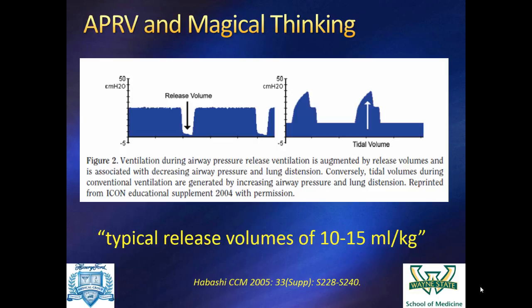So here we're going from one pressure to another, right? We're going from a pressure, let's say, of 10 to 30. Here, because we say we're going from a pressure of 30 to 0, somehow that's better than going from a pressure of 0 to 30, which is all we're doing. We're just doing it in the other direction. But somehow this is thought to be safe, and this is thought to be dangerous, and I cannot, for the life of me, understand why they're different.